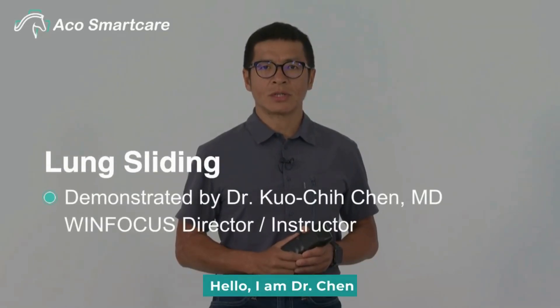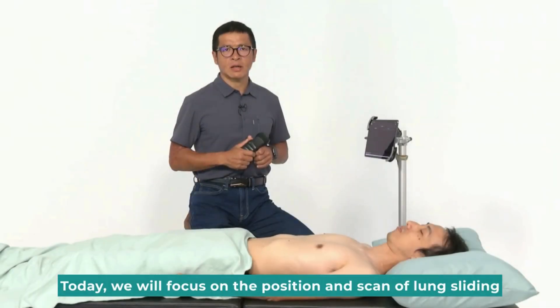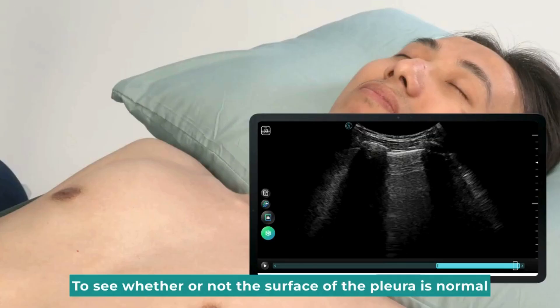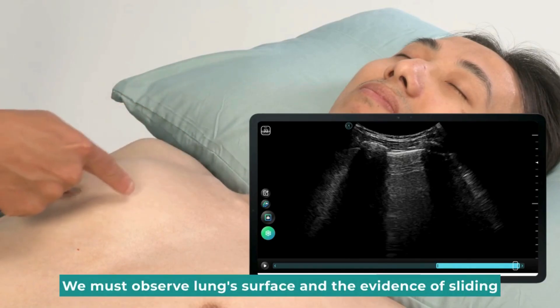Hello, I am Dr. Chun. Today we will focus on the position and scan of lung sliding, to see whether or not the surface of the pleura is normal. We must observe the lung's surface and the evidence of sliding.